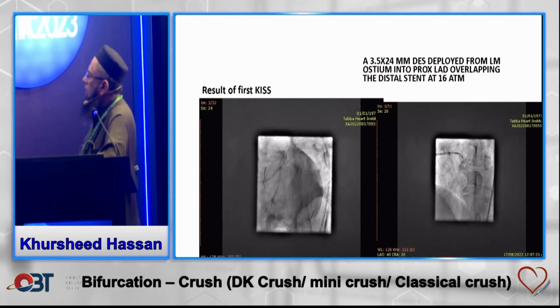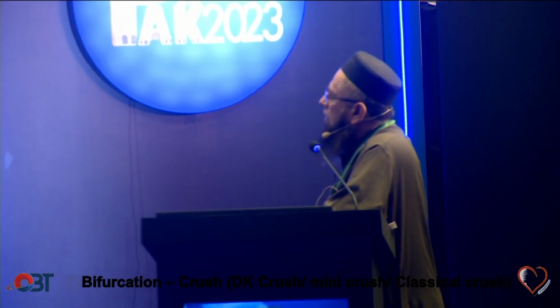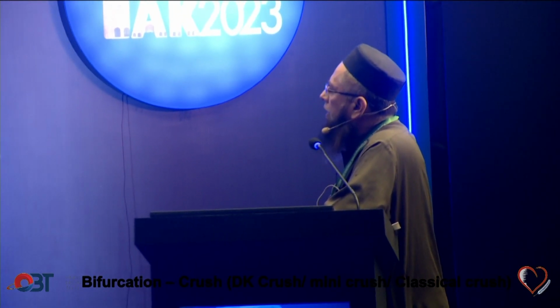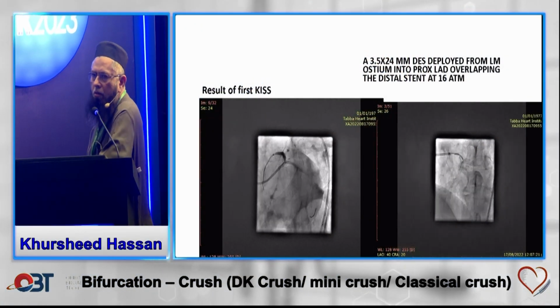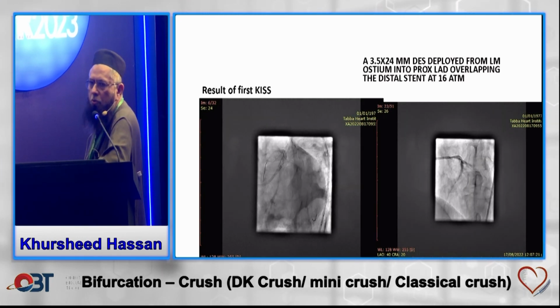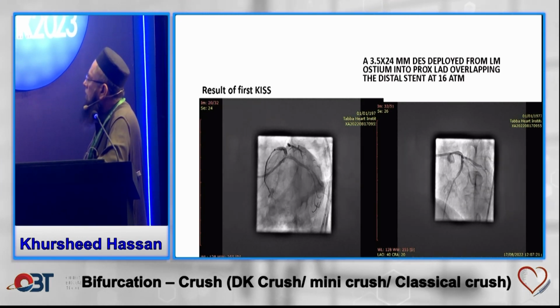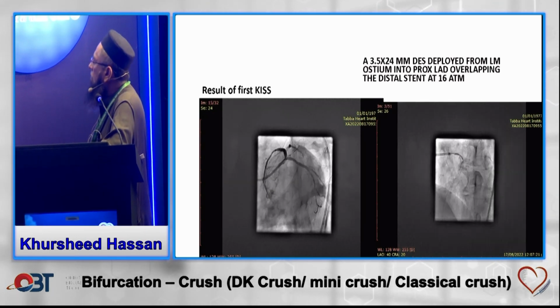So this is the stent in the ostium of the left main. This is a left cranial view, making sure that you are hanging just outside the ostium, not missing the ostium and not way into the aorta. This is an important step, making sure that you are well placed there.